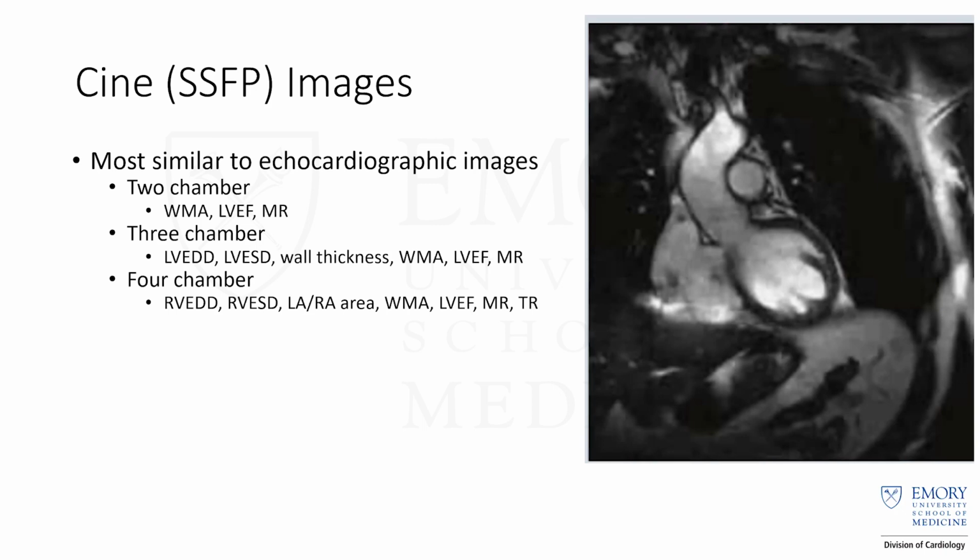They may be in congestive heart failure or have underlying lung disease. If you're looking for sarcoid and you've got a patient on a ton of oxygen, they may not be able to do adequate breath holds. So you have to keep that in mind when you're taking your images and figuring out your protocol beforehand to figure out what kind of images you're able to get.